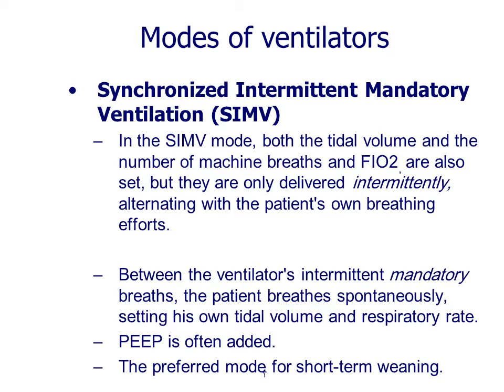Synchronized intermittent mandatory ventilation, SIMV. Both the tidal volume and the number of machine breaths and FiO2 are also set on the ventilator, but they are only delivered intermittently بشكل متقطع alternating with the patient's own breathing effort، متقطع ما بين النفس اللي راح ياخذه المريض منه لحاله. إذا هون المريض is able to take a breath، لكن برضو جهاز التنفس الاصطناعي راح يعطيه preset determined tidal volume and respiratory rate.